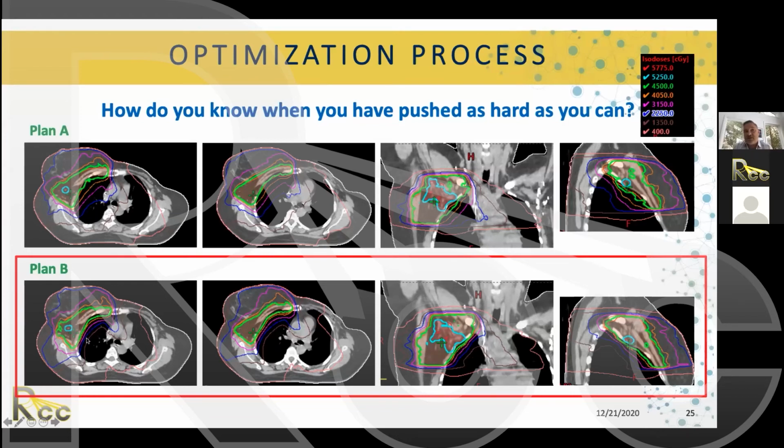Because doing an IMRT plan, yes, it's going to look amazing on paper. Look how beautiful the 100% looks here, covering everything. But if the patient moves, or is not well immobilized, or we didn't take care of the motion management, it doesn't matter how perfect you get the plan. That perfect 100% dose is not going to go every day to the target that I want. So that's very important too. Everything goes together here. Everything is related.